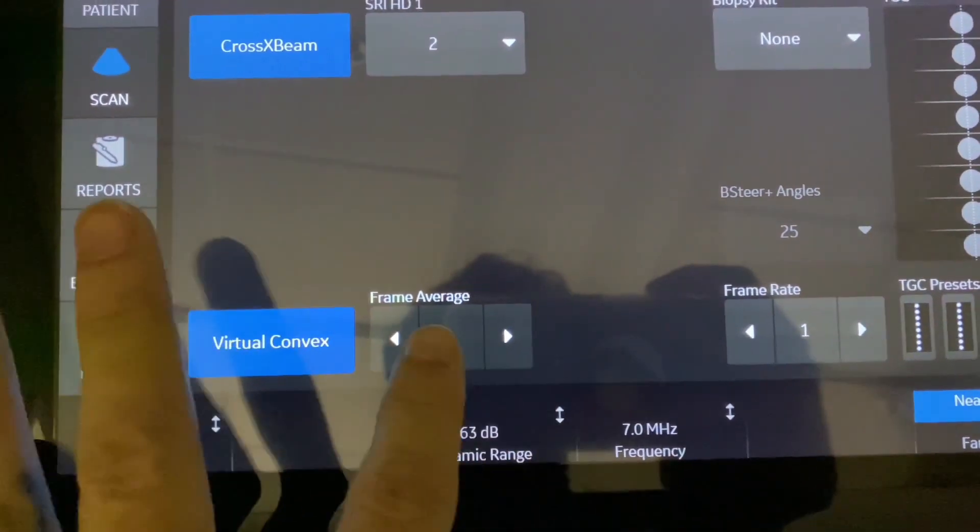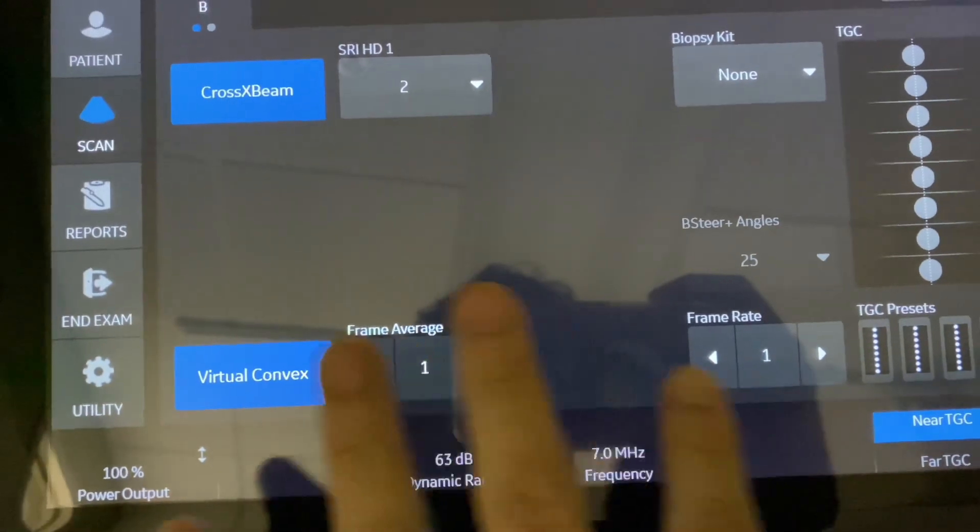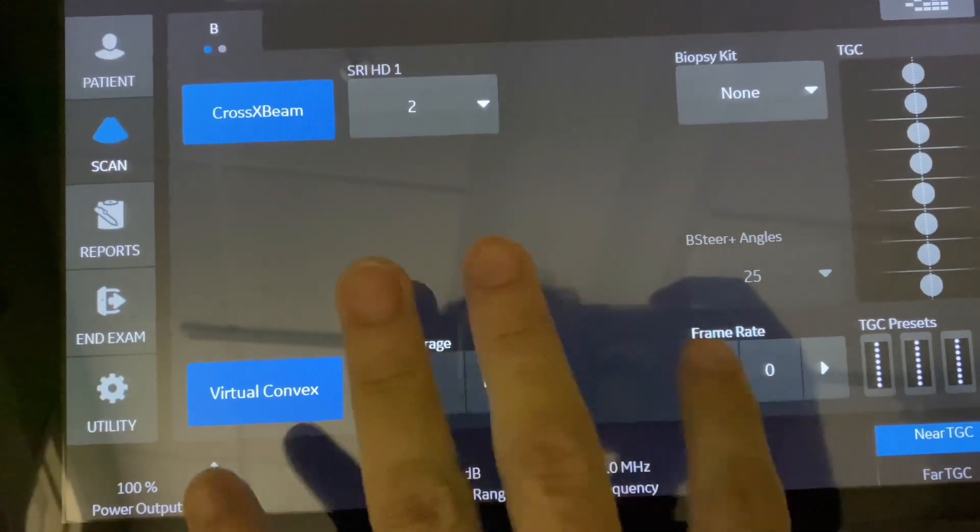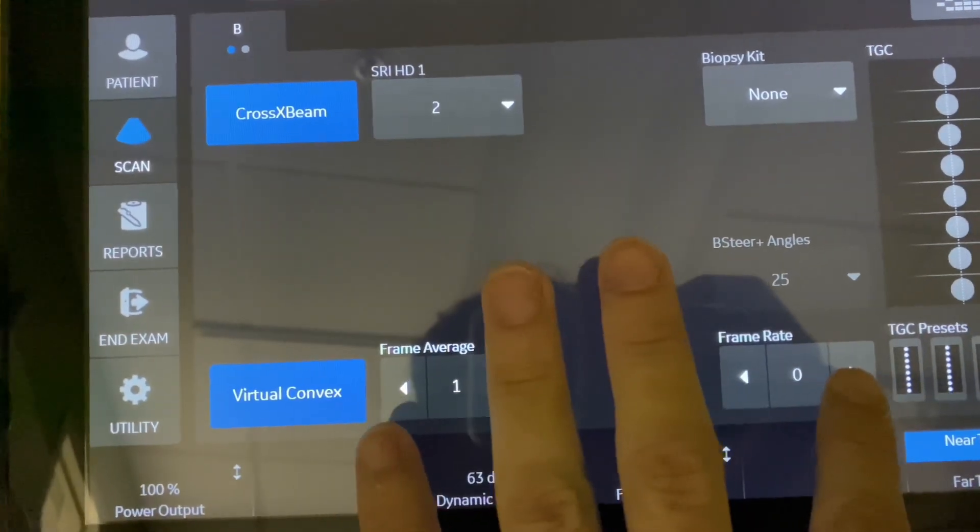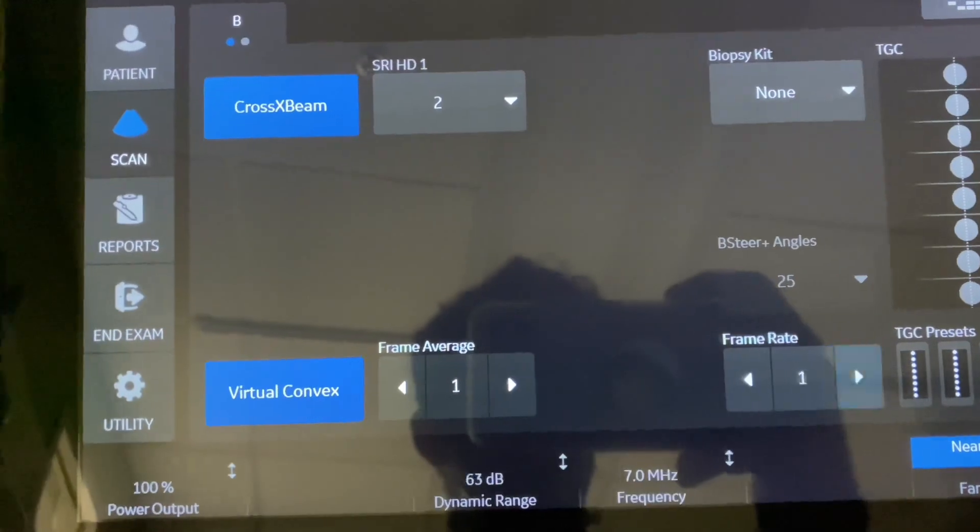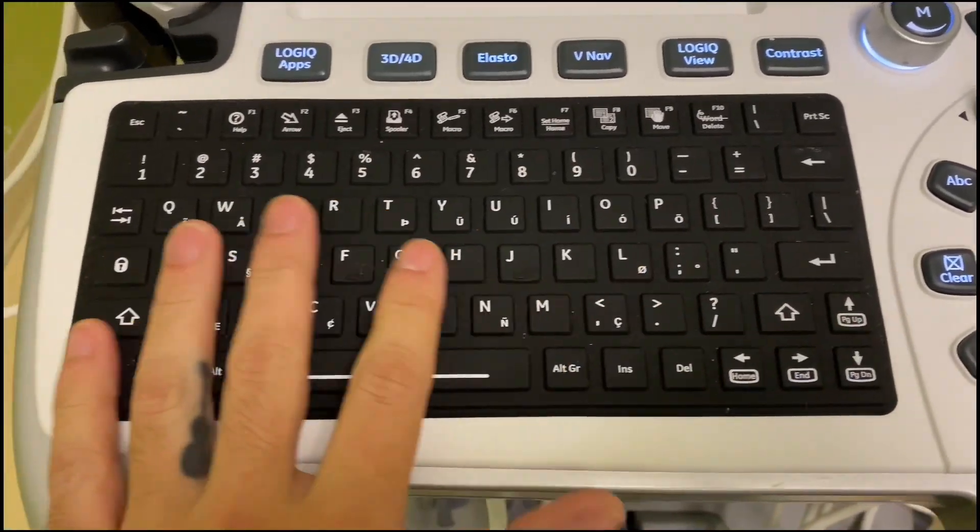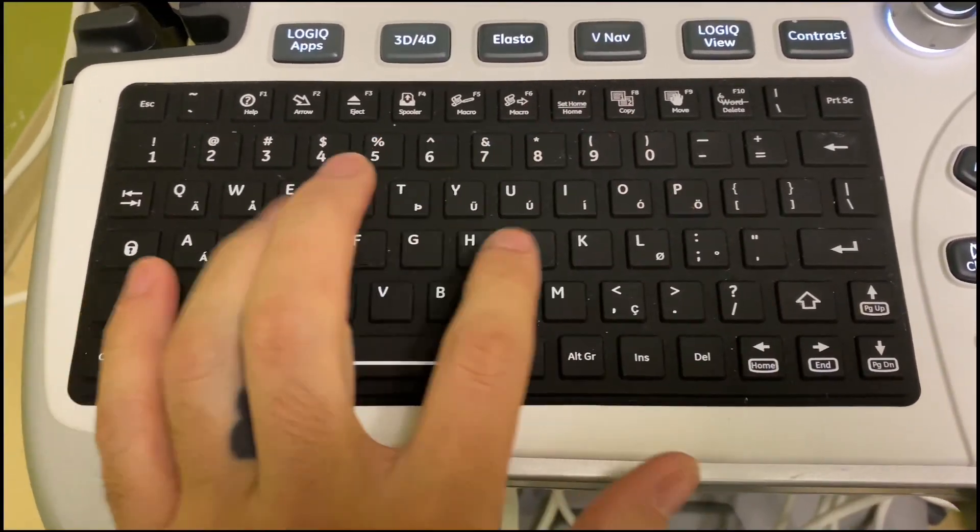All right, so frame average and frame rate, I always keep those low. Oftentimes I'll put these at zero too if I'm getting too much motion artifact. I really like this keyboard. It's soft.